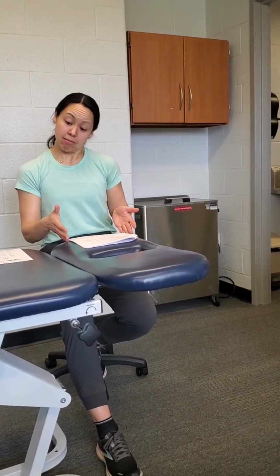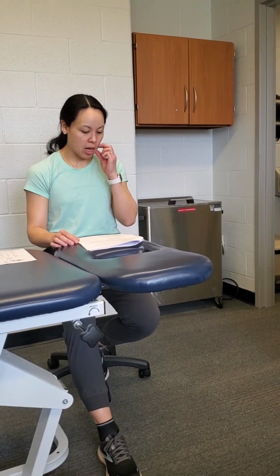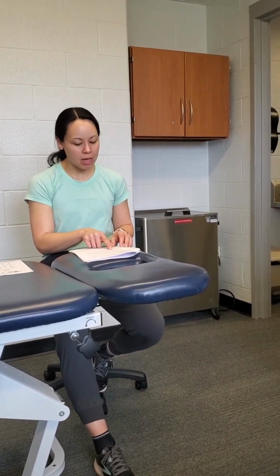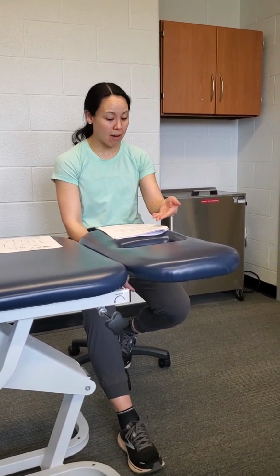Generally, he said during the course that it's generally safe, to be honest. Even if they have 2 of the 3, it says down here too. There's no signs of clotting cascades in the literature for young, old, cardiac patients or post-op patients, both in the acute or chronic studies, that there has been really any adverse events in all of the studies. So generally, it is pretty safe even to do with people who might have 2 of the 3.